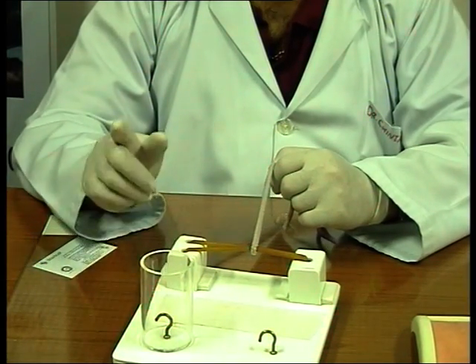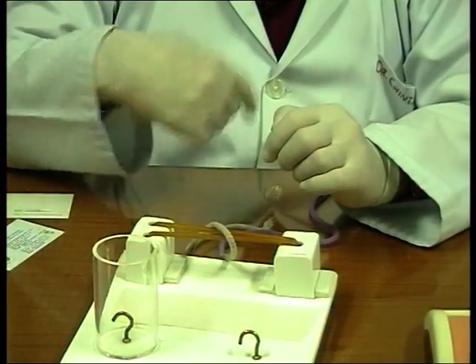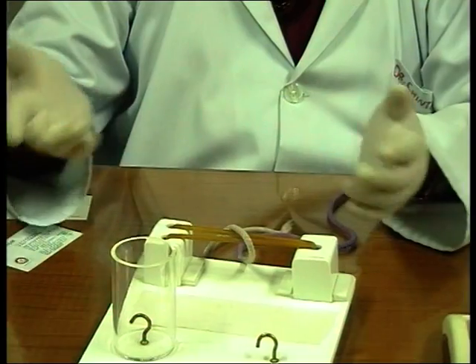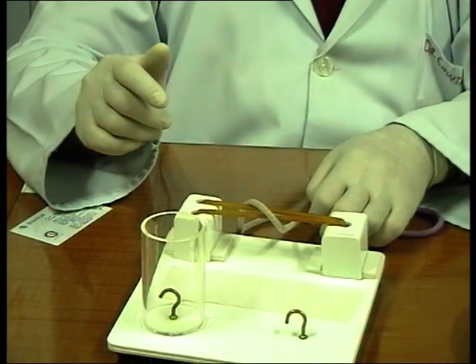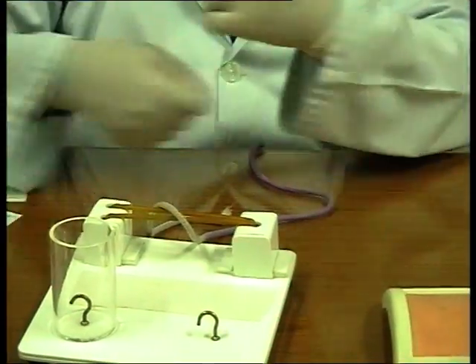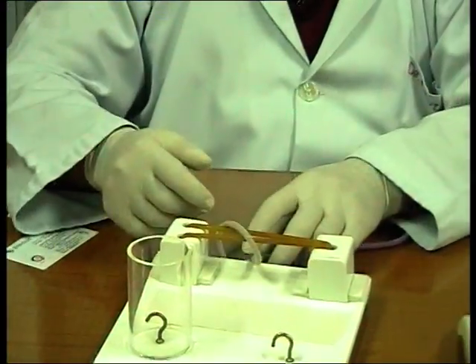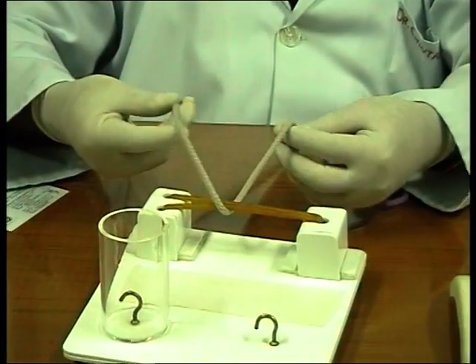And in the same exercise, I'll teach you that if you don't cross your threads, it's a slip knot, which is also called a granny knot. You see granny slipping the throws down constantly while knitting and then putting a secure knot, as I was telling you in the beginning. Otherwise, if they don't put a secure knot, what will happen? You just need one string to pull out the complete sweater. You just keep pulling and the person will be without it in no time. Therefore it's important. That's what knotting is all about.